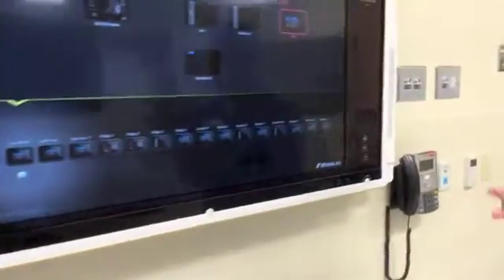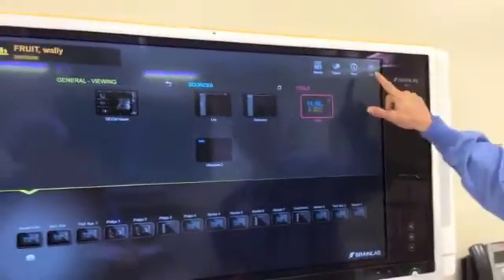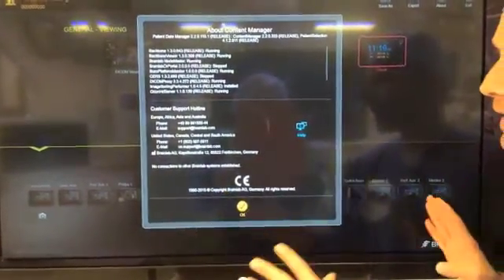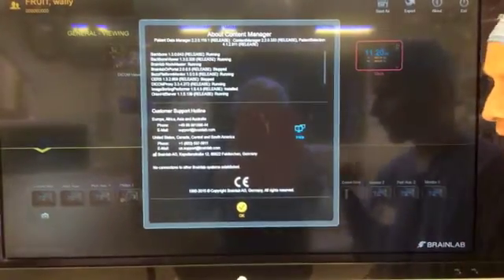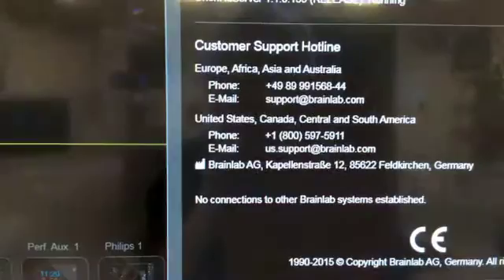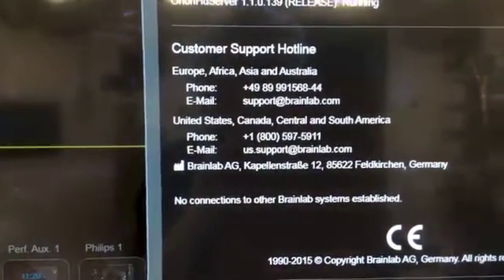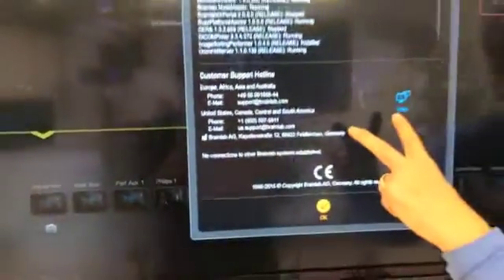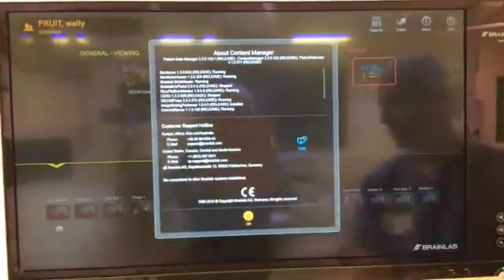The last troubleshooting I want to cover is our remote access option, which we find in the About button. Right up here at the very top there's an I — the information screen. We have a remote access troubleshooter called iHelp. If you select this, it's going to access a remote login session where our team will override the system and try to help troubleshoot from wherever the engineer is located. In addition to iHelp, if you need something right away, we have a 1-800 number — 1-800-597-5911 — and somebody is on support 24/7.